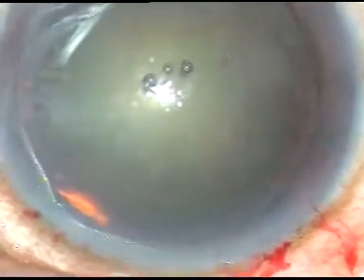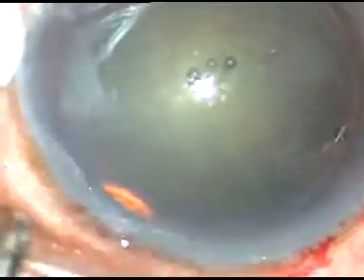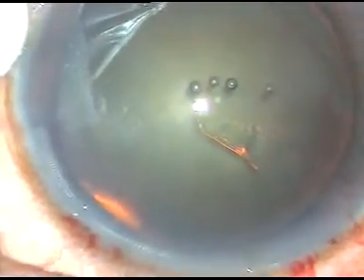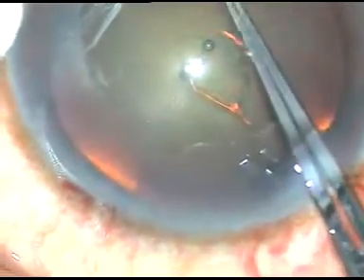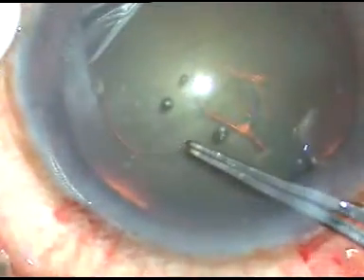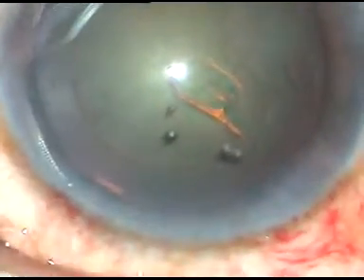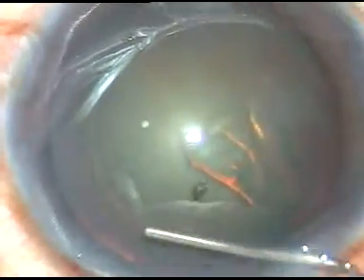Now, capsulorhexis is to be done. I use a 26-gauge bent cystotome to incise the capsule and raise a flap — raise a capsular tag like this. Now I use a Utrata forceps to hold this tag and perform the capsulorhexis. I am supporting the eyeball with a cotton-tipped applicator. We can see that the patient is squeezing the eyeball, but I am able to do this in spite of the patient squeezing his eyelids.